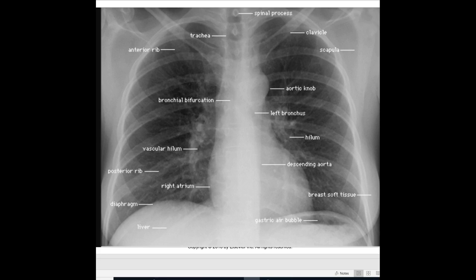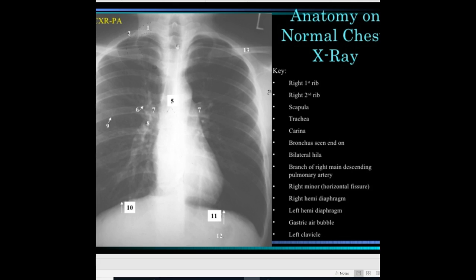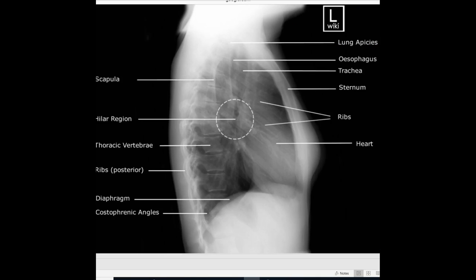I've added some images here with chest x-rays. When I come out to your sites and we look at your images, it's very important that you know each of these anatomical structures. I've added a slide showing normal anatomy, and your carina is at number five — that's important to know during image critique. I've also added a slide of your lateral chest; it's very important to know the anatomy when reviewing images in your clinic or hospital.